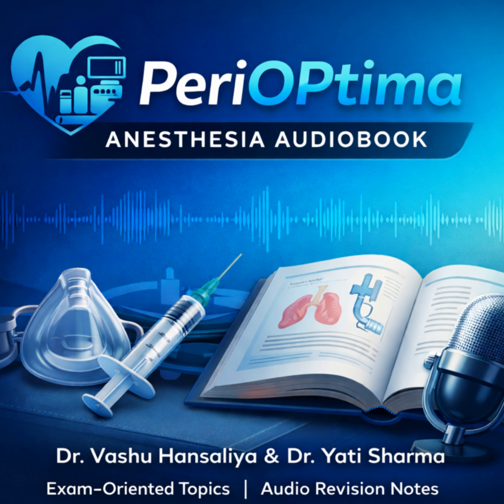You describe an elliptical silicone mask that's attached to a latex-free silicone tube. The mask has an inflatable outer rim, or cuff. The tube ends proximally in that standard 15mm connector. And crucially, on the laryngeal inlet surface, it has what are called aperture bars, sometimes called the epiglottic elevating bar. And what do they do? They're designed to prevent the epiglottis from folding over and obstructing the airway inlet, either during insertion or ventilation. And for the reusable CLMA, remember its lifespan, up to 40 uses, and it requires strict autoclaving and sterilization protocols.